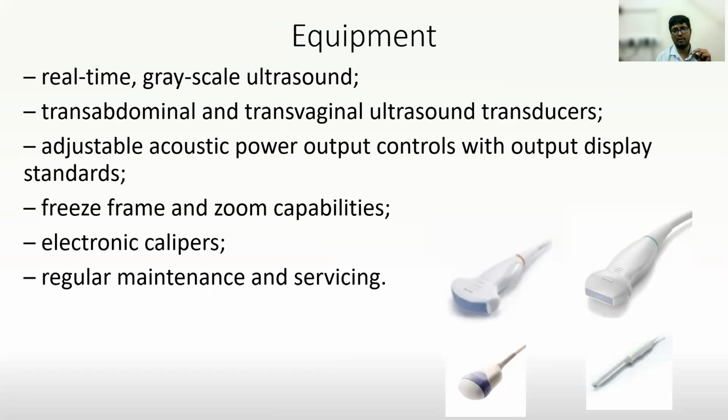All these things are a must to have an optimal image, because a suboptimal image might not give correct values, which might hinder the report and the result of the study. The choice of taking a curvilinear probe or a linear probe or a transvaginal probe or a 3D probe is left to the person who's doing the ultrasound. There are no strict rules, but if someone is comfortable with any probe, they can go ahead and do it. The disadvantage is that a linear probe does not have a good penetration level, but the quality of images might be very high and it can be used in a very thin patient.